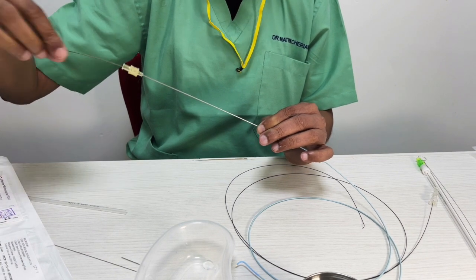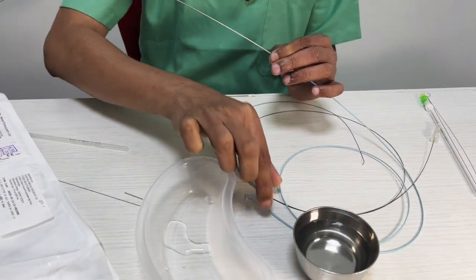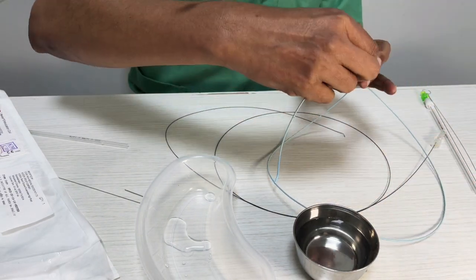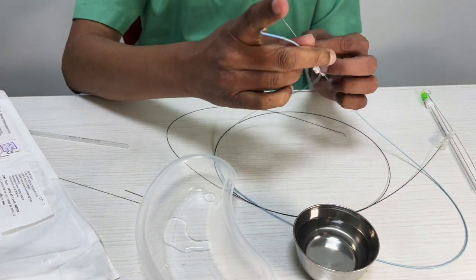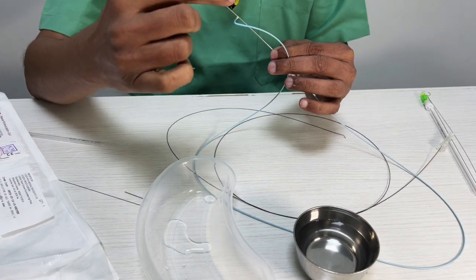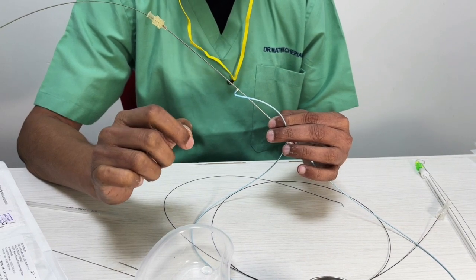And after a point of time, you can see it fluoroscopically and it will exit out from this point. Okay, it's going to exit from here. So remember, the positioning of this tip is very important. It will determine how your coil will behave.